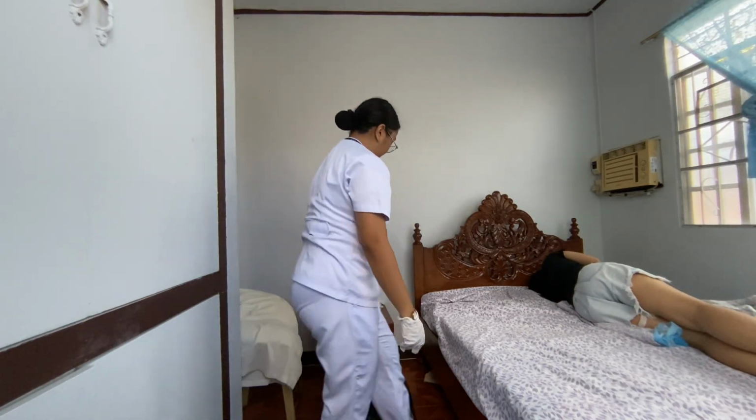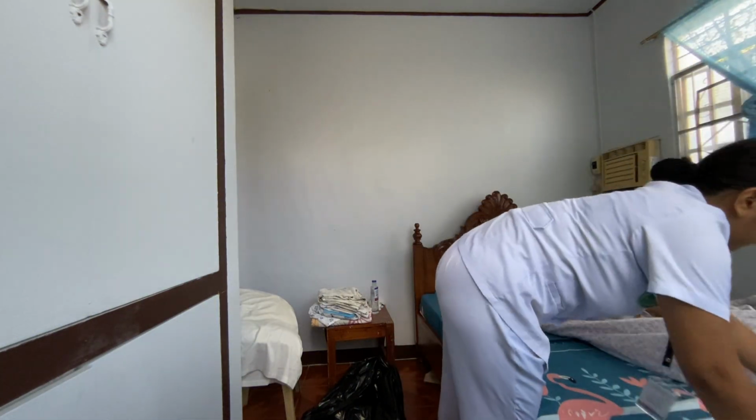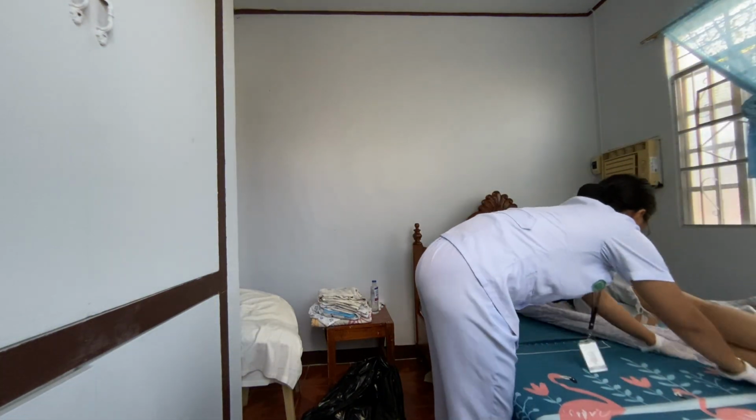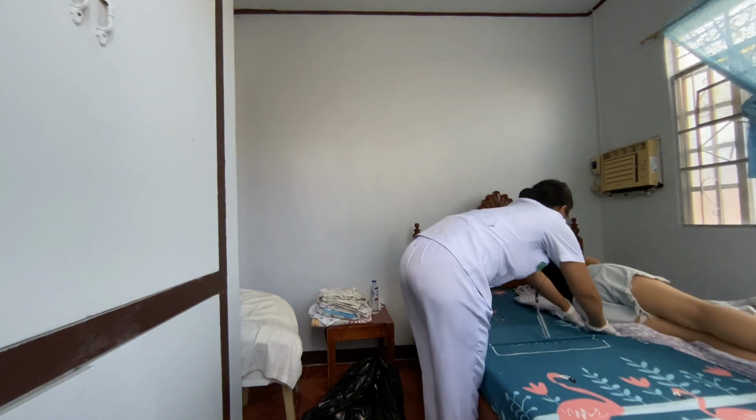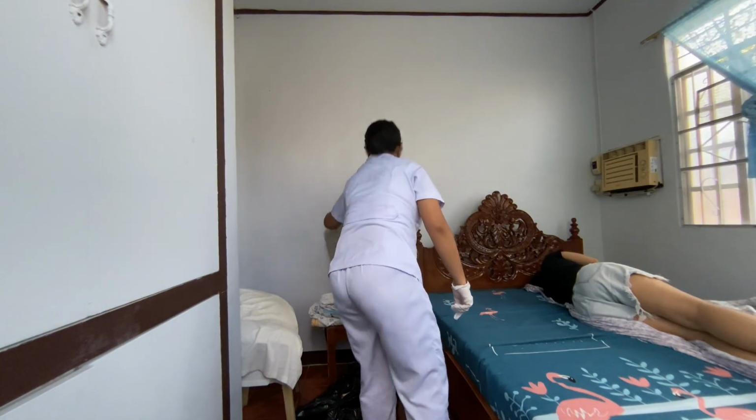Loosen all bottom linens from head, foot, and side of the bed to facilitate removal of linens. Fan fold soiled linens as close to the patient as possible. This makes it easier to remove linens when the patient turns to the other side.